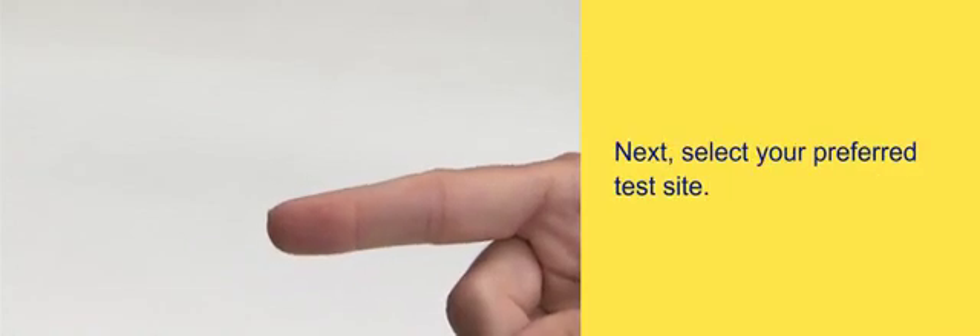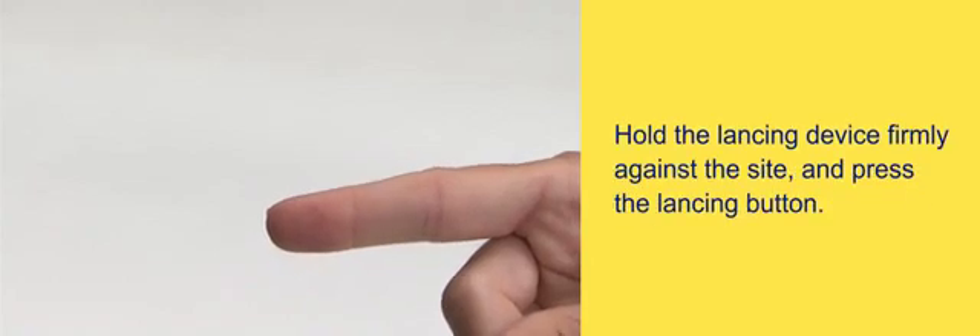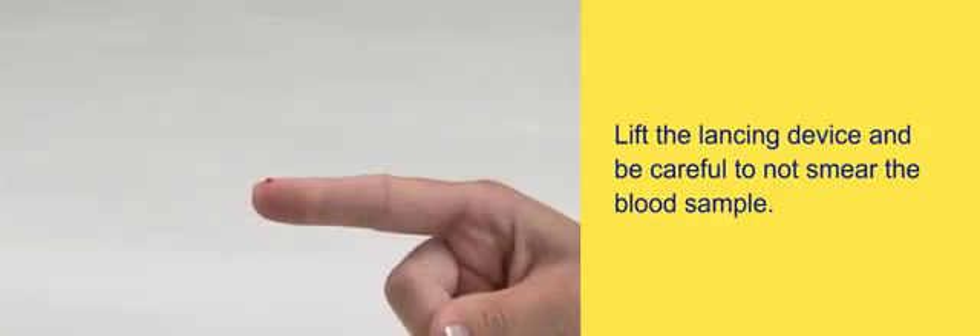Next, select your preferred test site. Use the lancing device to obtain a blood sample. Hold the lancing device firmly against the site and press the lancing button. Lift the lancing device and be careful not to smear the blood sample.